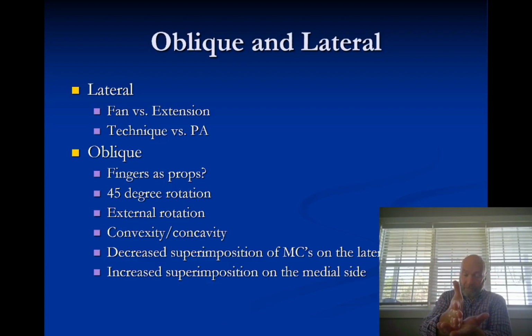And they would step back to the control panel and make an exposure with the thumb sticking straight up in the air like that. You're not going to get any kind of analysis of the thumb if it's sticking up like that. So yes, you have the patient do that, and it's a good way to describe the position to the patient, but make sure that you lower that thumb so that the thumb is also parallel to the image receptor. So this is an extension lateral.